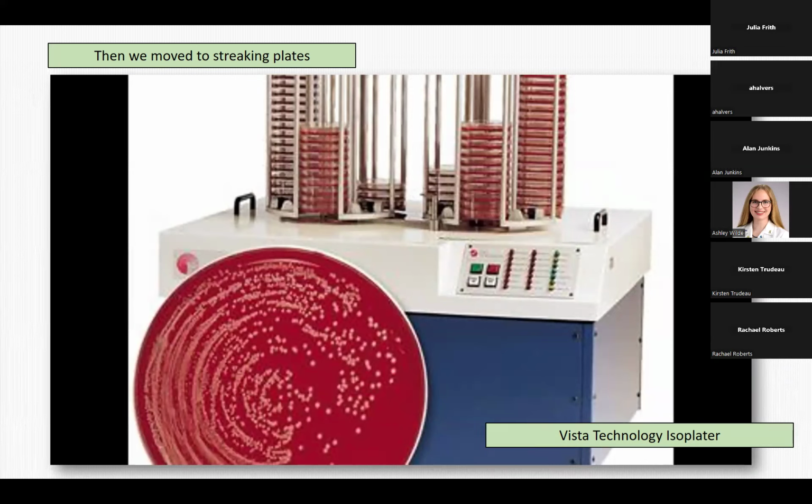Then you had to mark on the plate where the specimen was so that the machine knew that. Then you had to load the plates onto the machine with the specimen already on there. It would streak it, and then you had to offload the plates. So it sounds good, but it actually was not a time saver at all. As long as you're putting the specimen on the plate, you might as well just go ahead and streak it and save some time. So it never really caught on a whole lot.